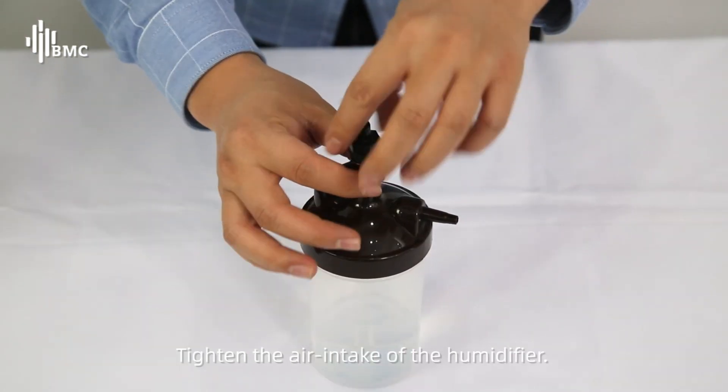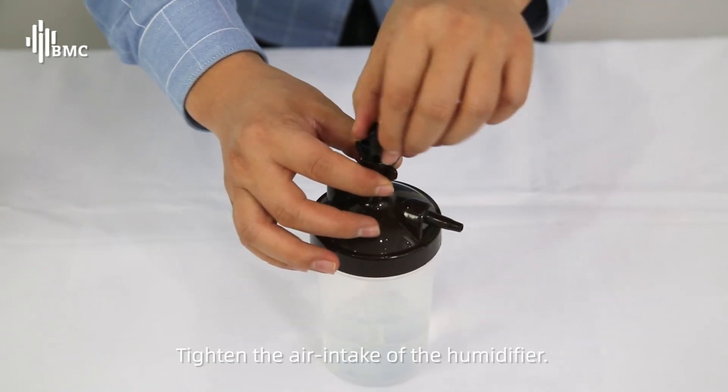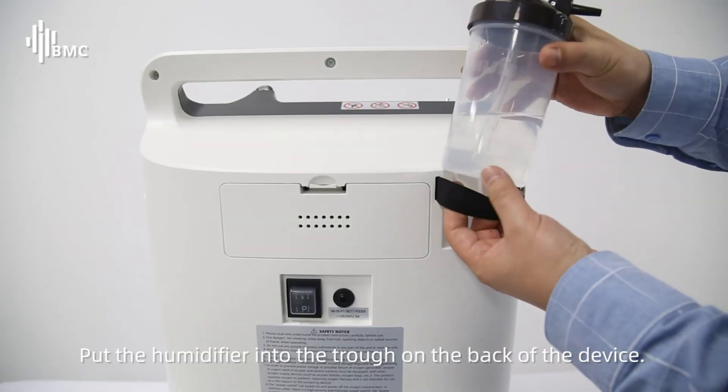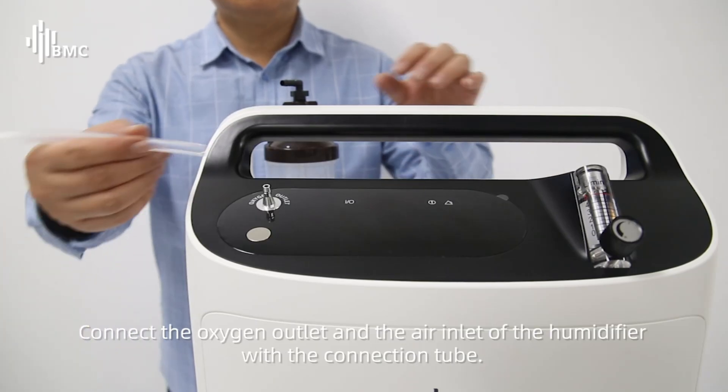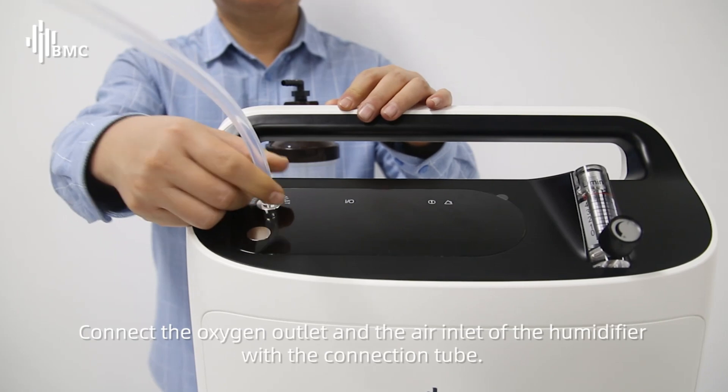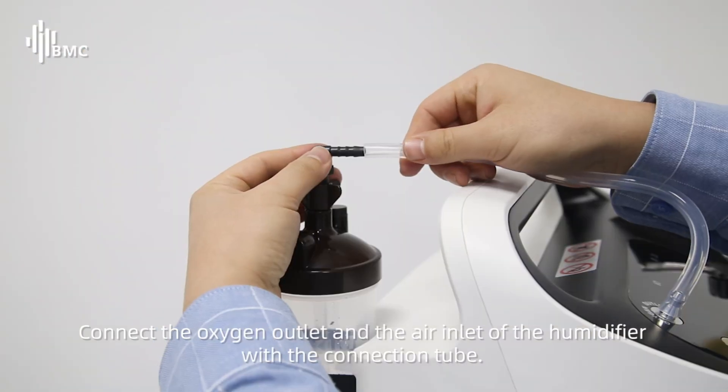Tighten the air intake of the humidifier. Put the humidifier into the trough on the back of the device. Connect the oxygen outlet and the air inlet of the humidifier with the connection tube.